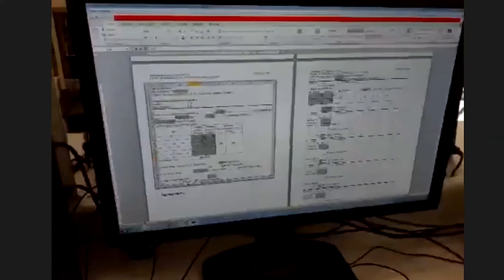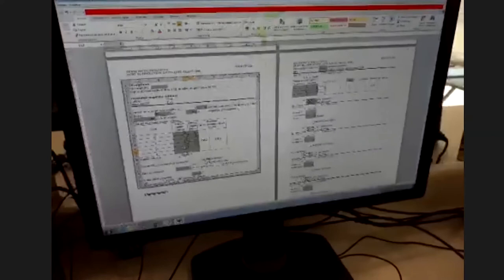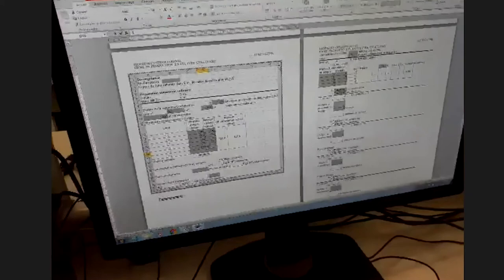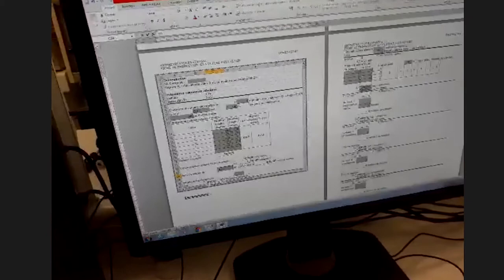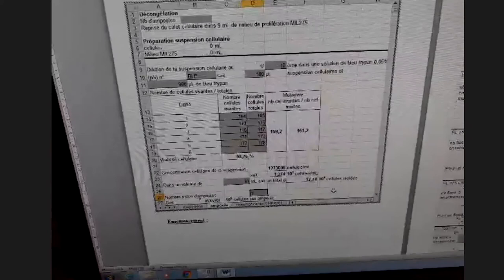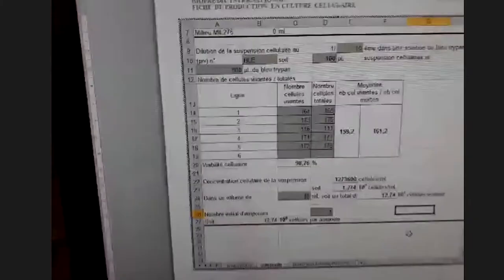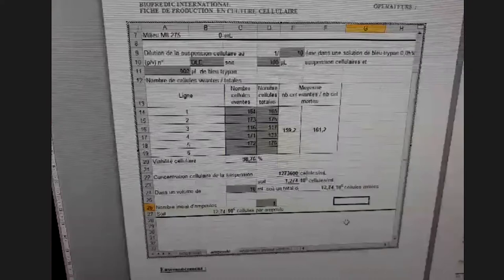We should assess cell viability to make sure that the cells are still viable, because DMSO — used as a cryoprotectant — is very toxic to cells. Otherwise, we may notice six hours after seeding that cells cannot adhere because we have only dead cells.